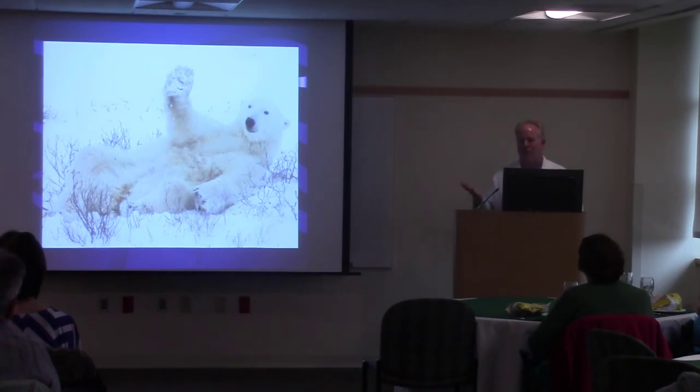But your heart can tolerate a few seconds of not getting any blood flow. Patients respond, they rebound pretty quickly. The patient that you showed that had the valve balloon, that was done before, and then we used the pump afterwards. You couldn't use this pump to help you put it out.